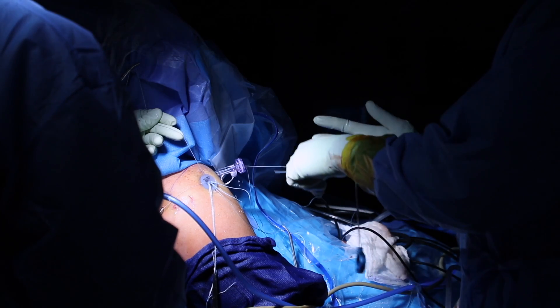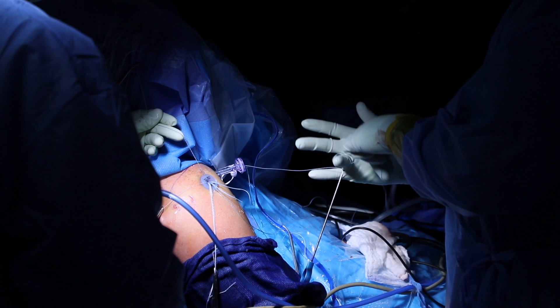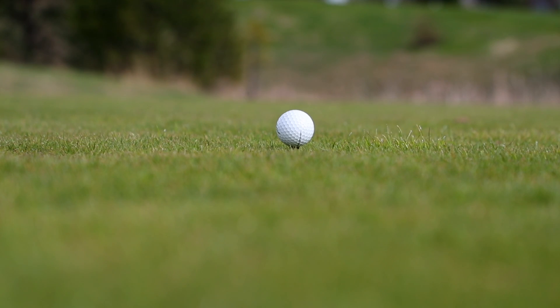We've been able to adopt a skill set which is unique in that we do all of the dermal allograft augmentation procedures through the scope, which decreases pain and allows patients to achieve a quicker recovery.